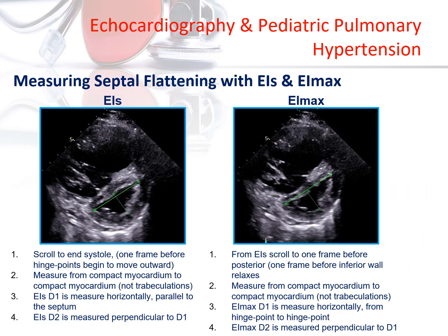Measuring septal flattening with the eccentricity index. I'm not going to go very far into this slide. However, if you'd like to learn more about this, you can always refer back to it.